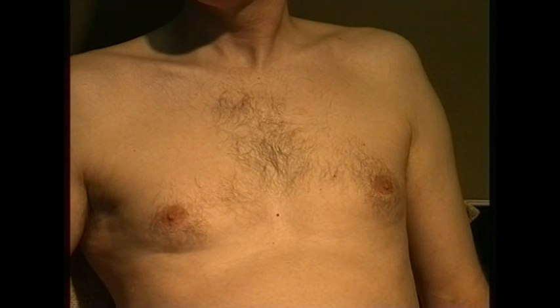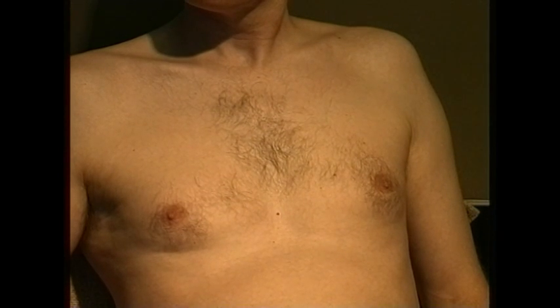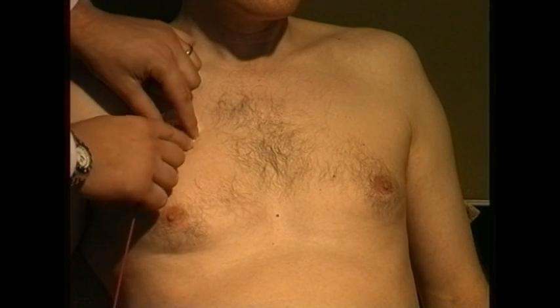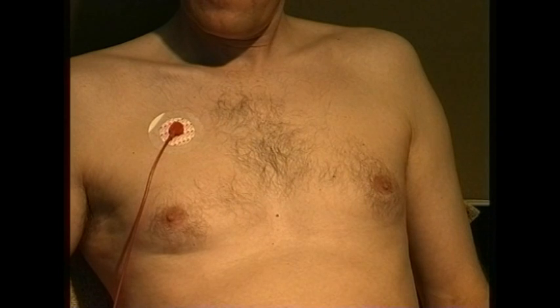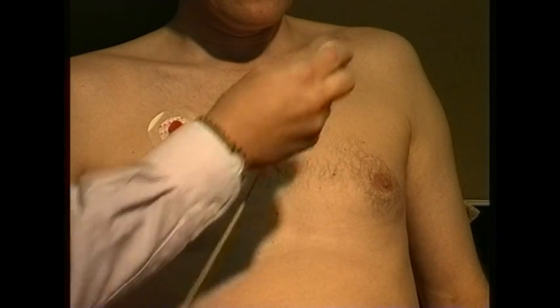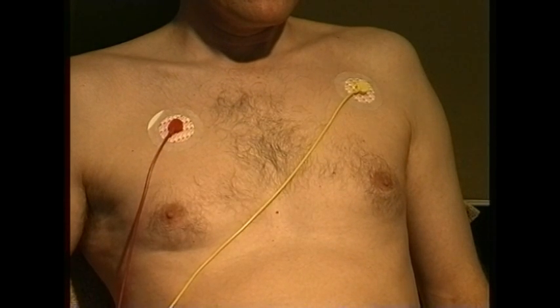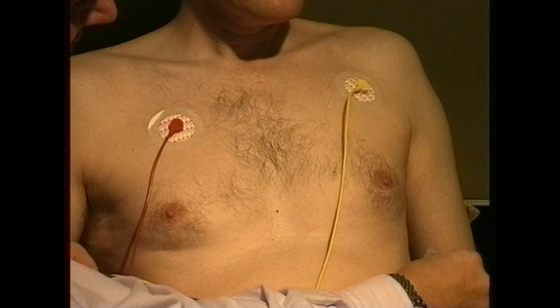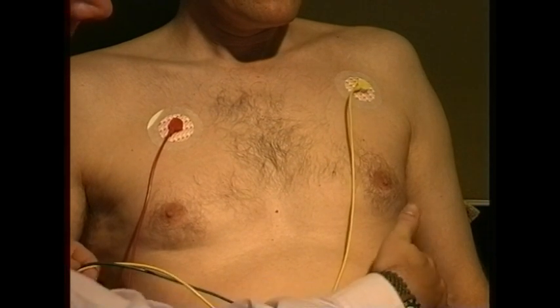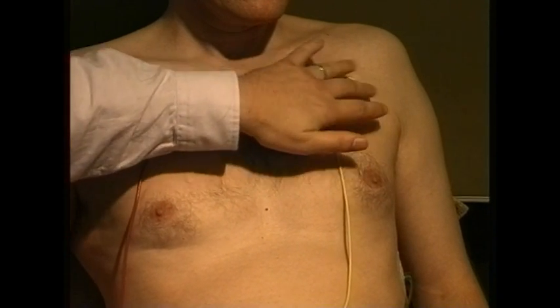Now we're going to attach the leads onto the chest via the electrodes. We have three leads, and these are placed across the chest. The first lead — the red lead normally — is placed on the right-hand side of the chest, just below the clavicle. The second lead, which is normally the yellow lead, will be placed on the left-hand side of the chest, just below the clavicle. The third lead, which is normally the green lead, will be placed on the left-hand side of the chest, just underneath the nipple. Once we've attached these, we need to make sure they're firmly connected so we have a good connection on the screen.